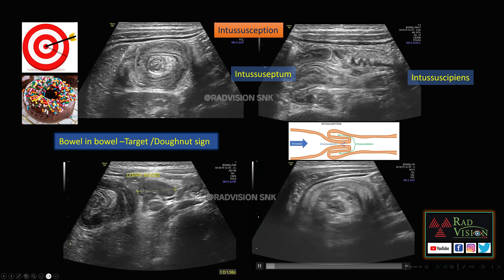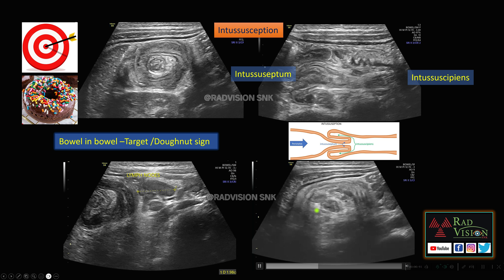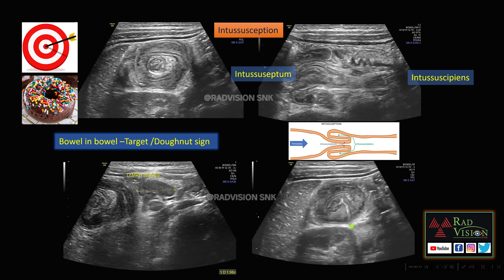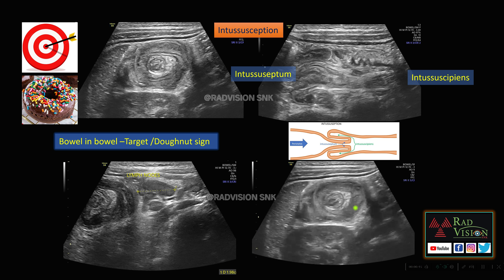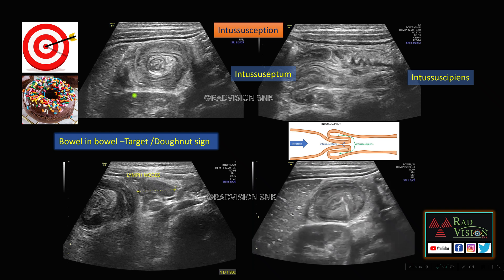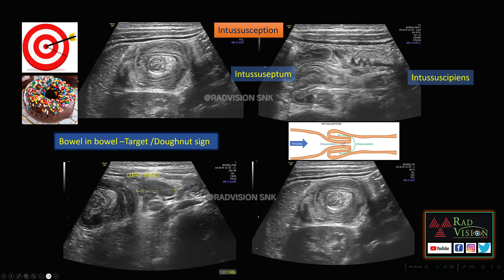Clearly you can see this is the bowel-in-bowel pattern where there is invagination of one part of the bowel into the other part of the bowel. This is typically classically called as bowel-in-bowel appearance, or target sign, or donut sign, seen in intussusception.